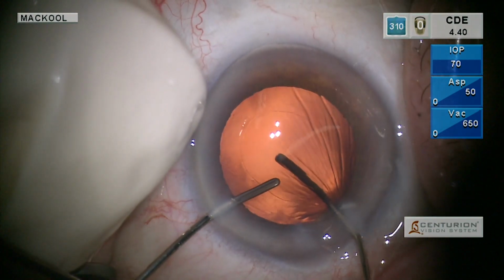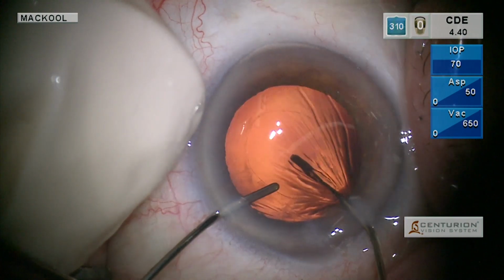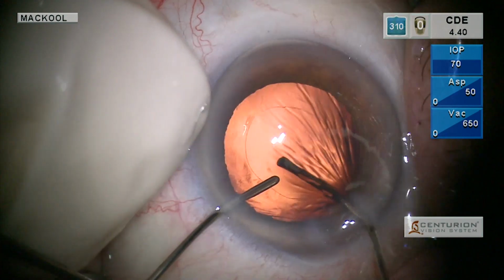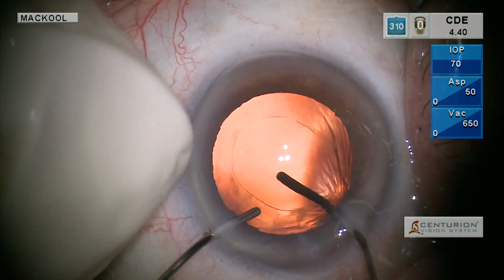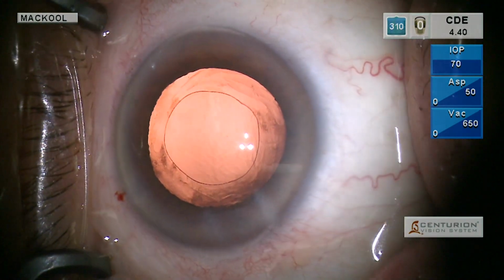Good. So I'm just holding the globe where I want it, and I'm injecting OVD, and it's such a deep chamber. Good. At the cornea.